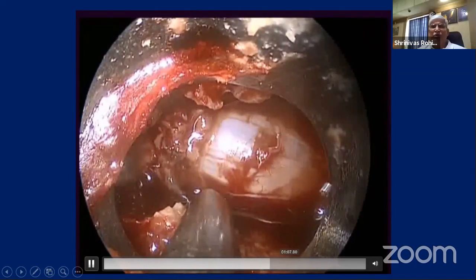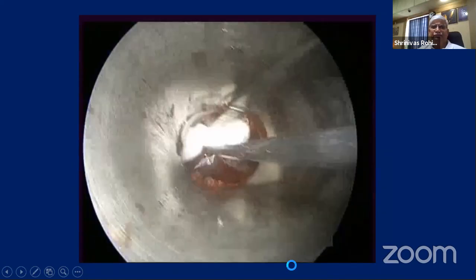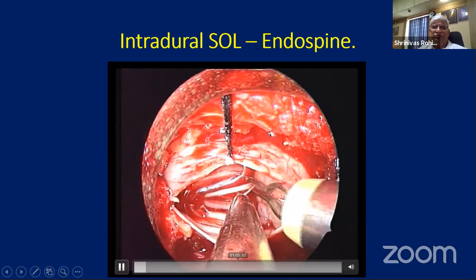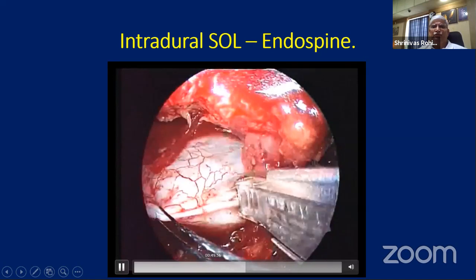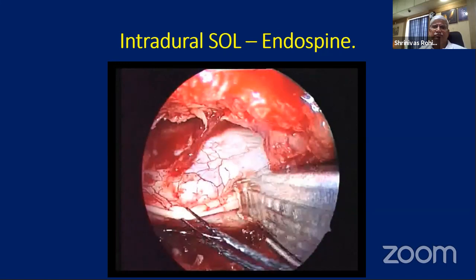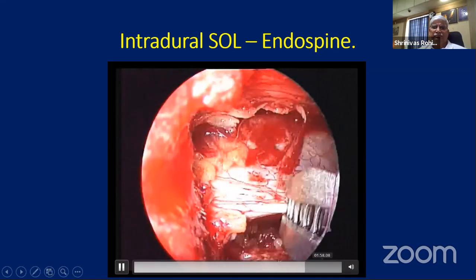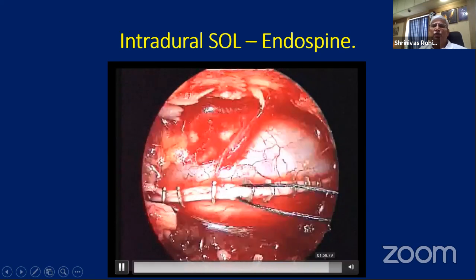And over this, we can put a tissue dura patch like this. You can use this system for intradural tumors also, and I'll just show you how we can use the Anastoclips. This is for wide dural tears. It's a watertight closure with 2 mm titanium clips.